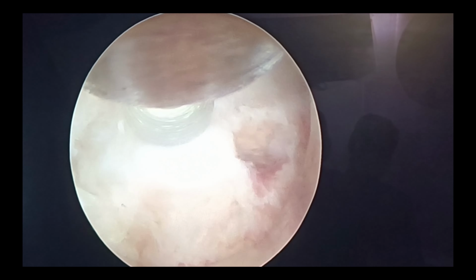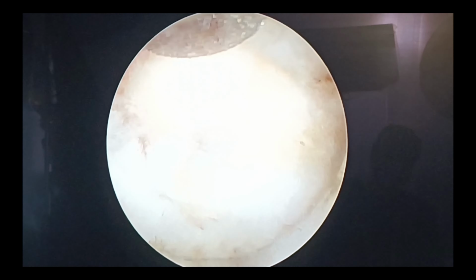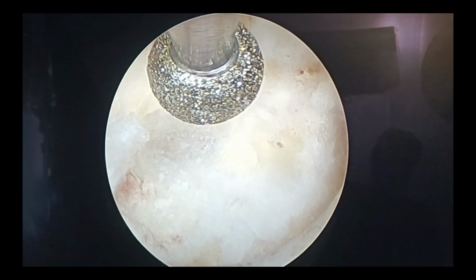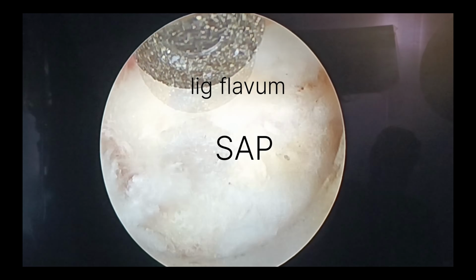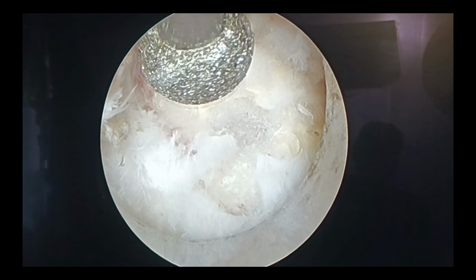This is laterally, that is towards the D10 IAP, and once we get the half facet drilled, we start seeing the SAP, and that's when our orientation becomes easier and we can proceed faster.